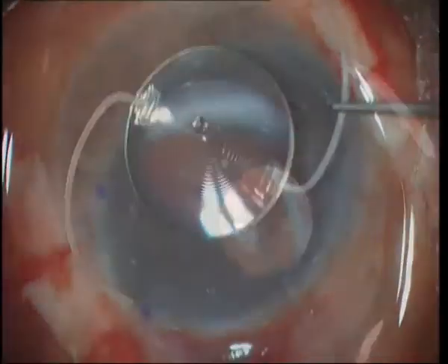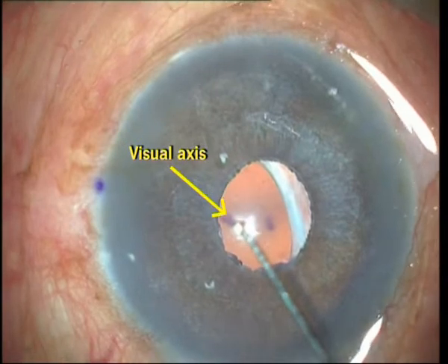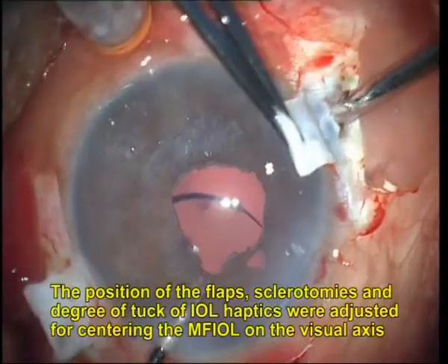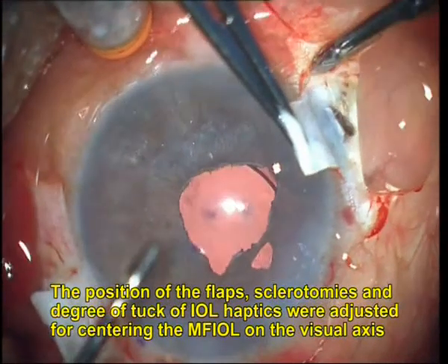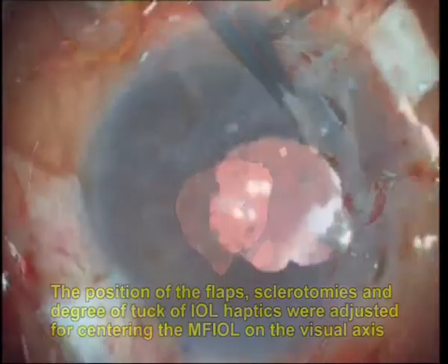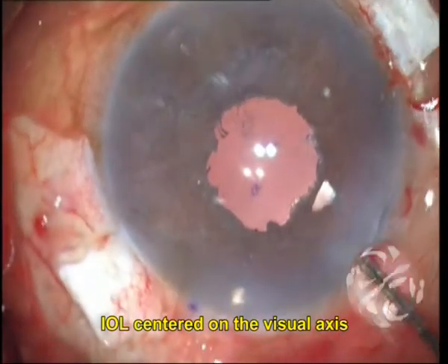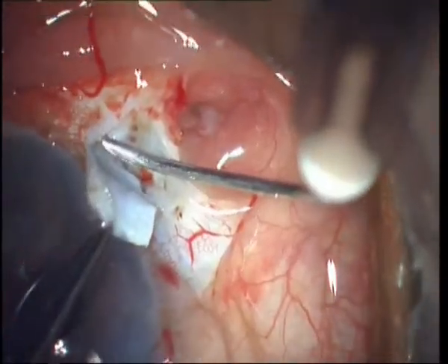We marked the visual axis using the coaxially sighted light reflex. We then marked the pupillary center and centered a multifocal IOL using the glued IOL technique. Despite the inability to ensure perfect accuracy, we did observe promising results with this technique.